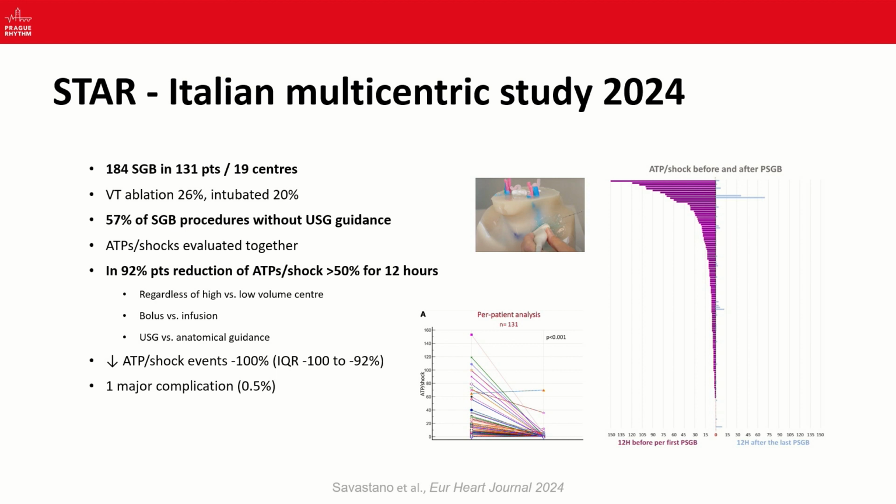More recently, there was a multicentric study published from Italy, which included 184 procedures performed in 131 patients in 19 centers, although most of the procedures were performed in 2 of the centers. In this series, only 26% of the patients underwent VT ablation, and only 20% of them were intubated. On the other hand, 8% of the patients had a refractory cardiac arrest, interestingly.